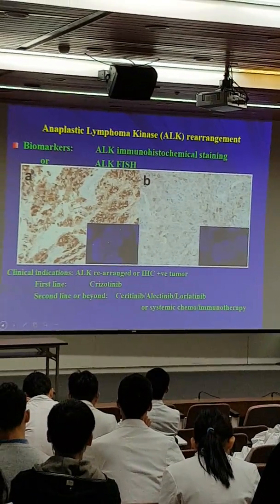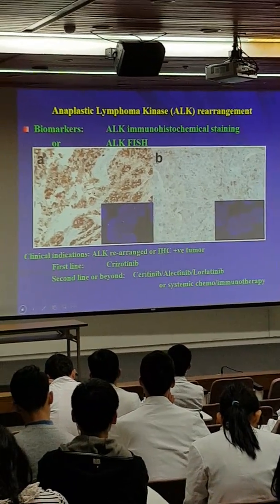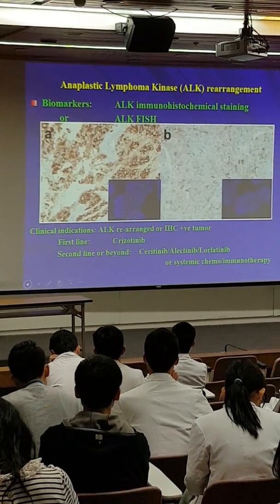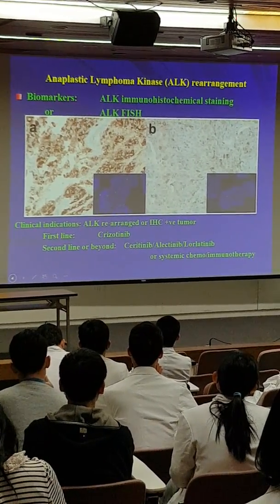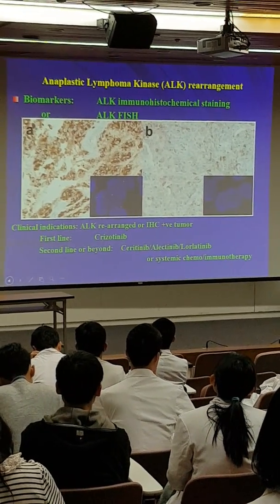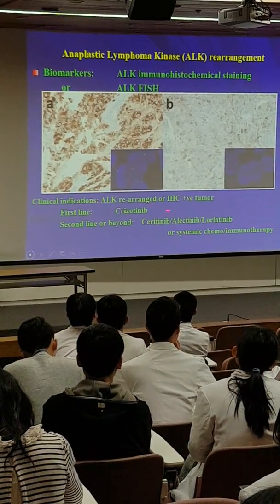for you to detect, sometimes they will be arranged on a different dimension. And the arrangement may be seen end-on, just like vessels on chest X-ray. So the scoring of this FISH probe requires expertise with cytopathologists. So right now, and this is expensive.